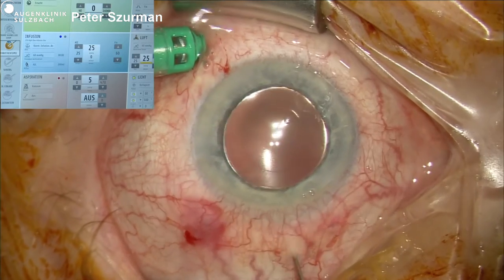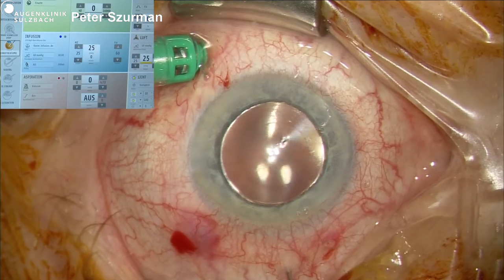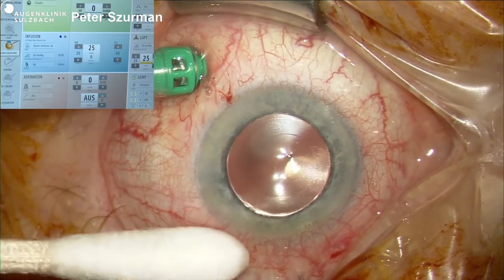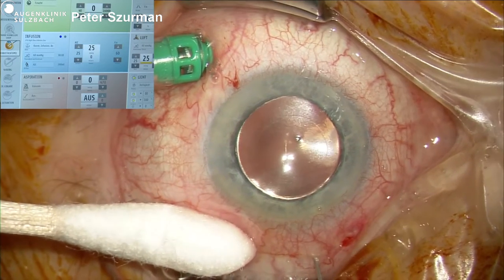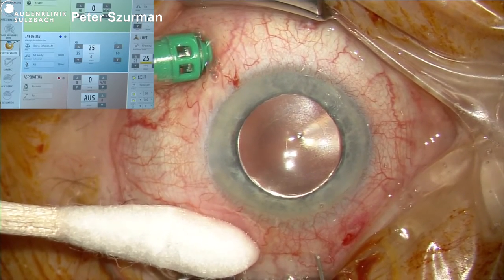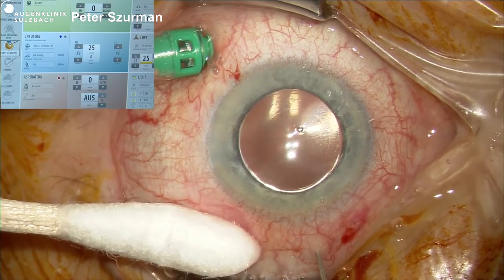This is very important in retinal detachment surgeries where we can actually view the periphery much better and in a higher magnification than what we usually do. And later on when we will go to the macula itself, we will actually see this picture again.